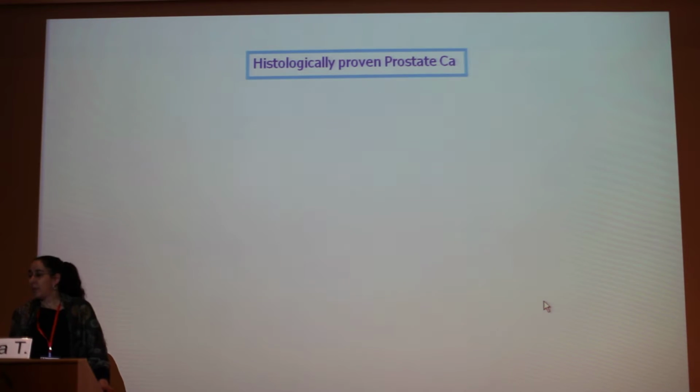So, when we just started doing prostate MRI, and I've been doing prostate MRI before dynamic contrast enhanced imaging and before diffusion weighted imaging, when all we looked at was the T2 weighted images, it was a very short 15 to 20 minute examination, and we did the best we could.